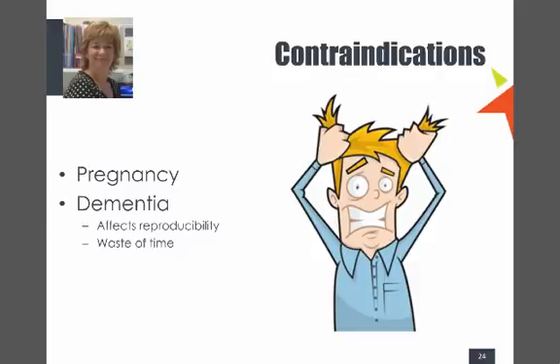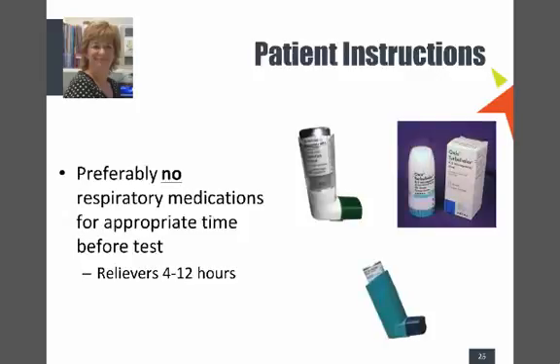And dementia, you don't bother wasting your time. As I said before, it's not going to be reproducible. You're wasting your time, and it's torture for you, the patient, and the carer. And you're really not going to get anything that is worth any value out of it.